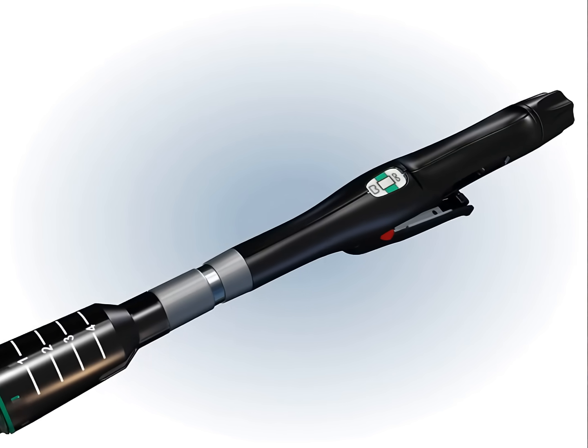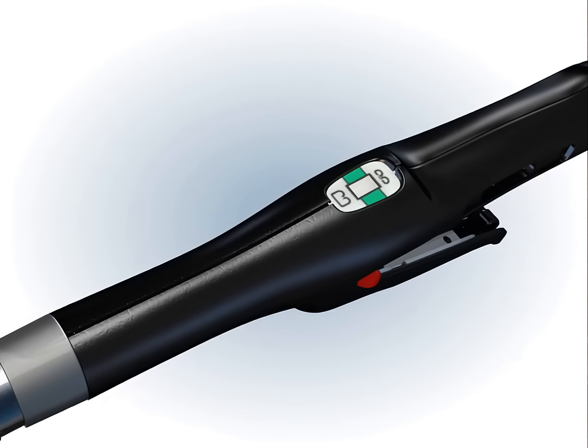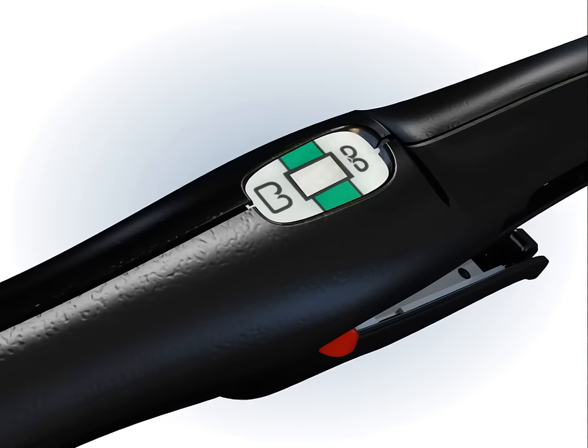As the stapler is closed completely, the orange indicator will advance to the low end of the green gap setting scale toward the smaller B-shaped form for the shortest closed staple height.